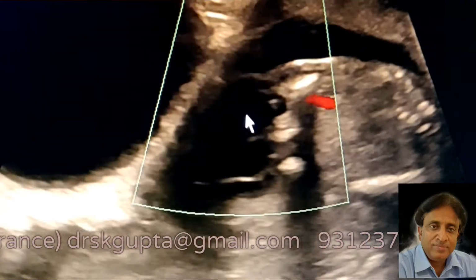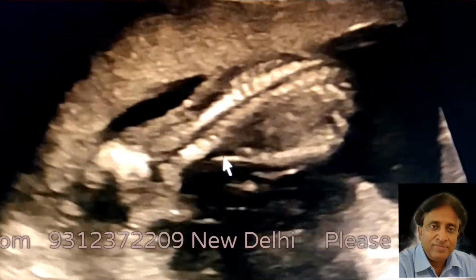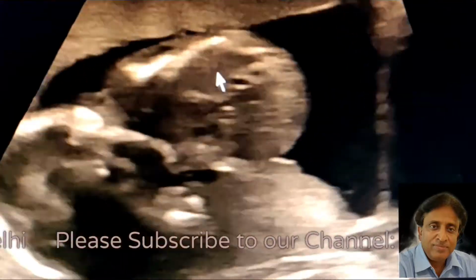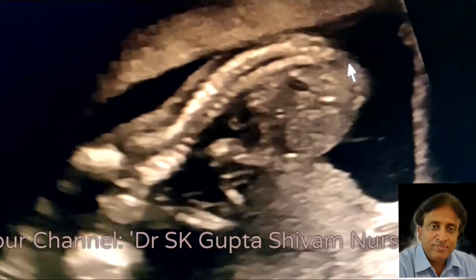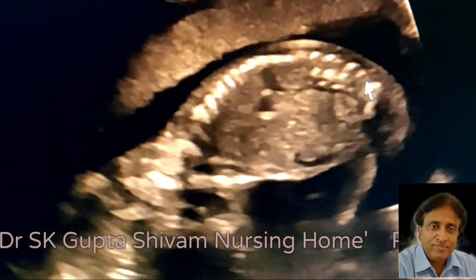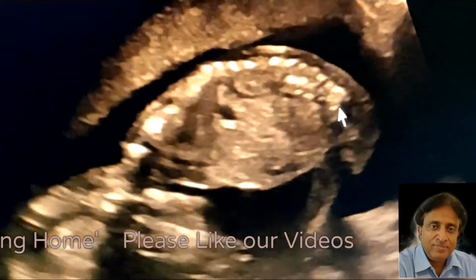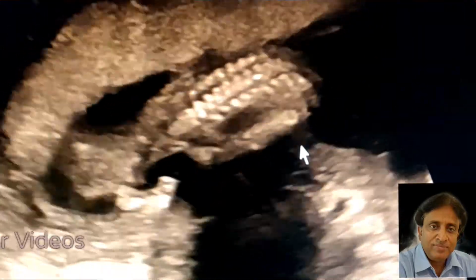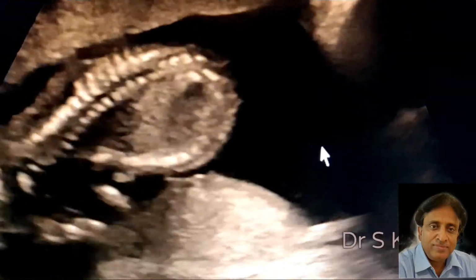Let us try to see the rest of the spine. This is the spine, this is the cervical region. Trying to follow it down below, the spine appears to be normal. In the thoracic region, the spine appears to be normal. And let us try to go down. We are going down into the lumbar region, and we find that the spine over here in the lumbar region also appears to be normal, but suddenly we find that there is a cystic swelling in the lower part of the coccyx and the sacral region, which is nothing but the meningocoel.